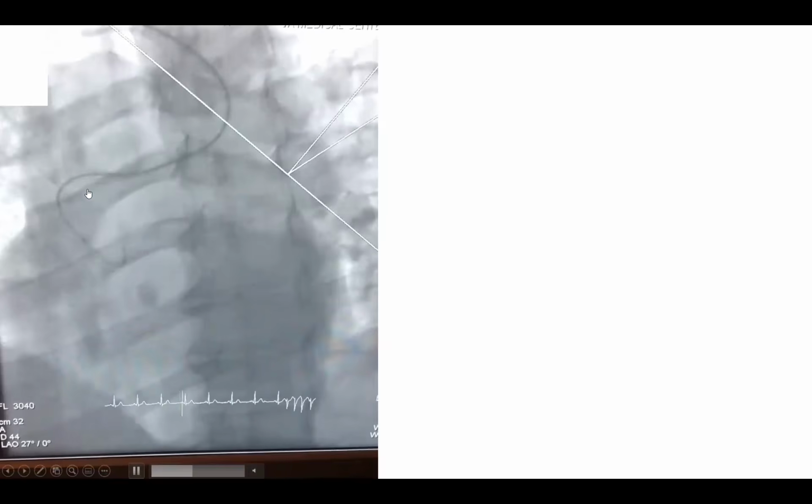So those are cases of difficult coronary engagement. This is a patient with a very sharp innominate aortic angle, okay? So we're advancing. This is what I always describe: you try to shove that catheter over the wire, and the whole system prolapses out. You need finesse here.